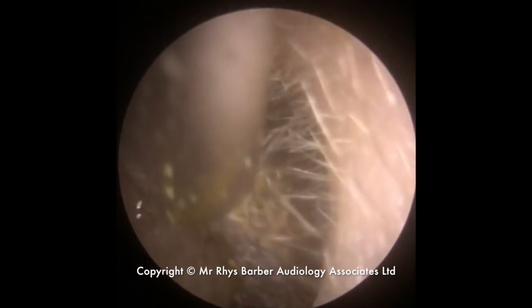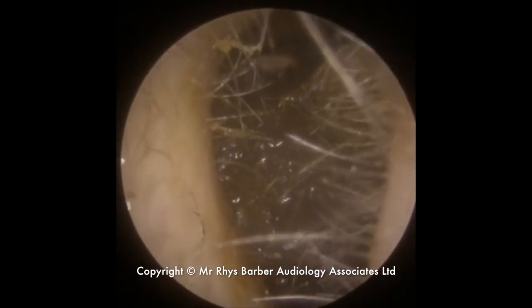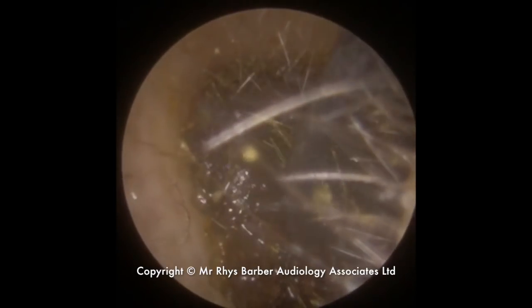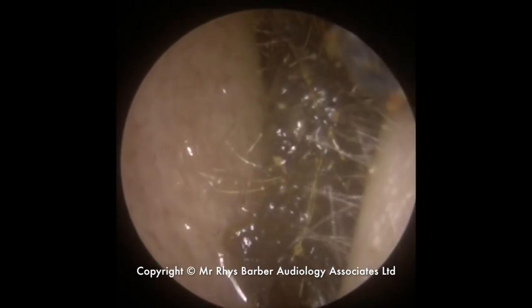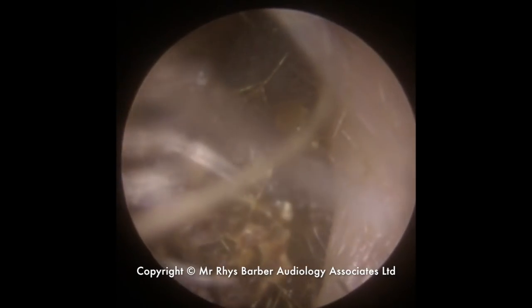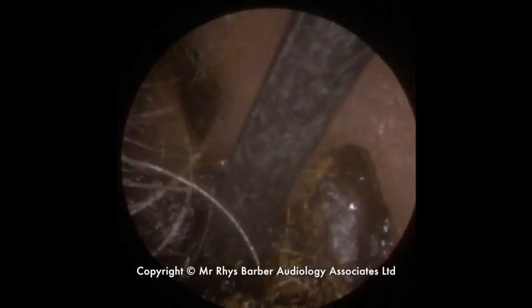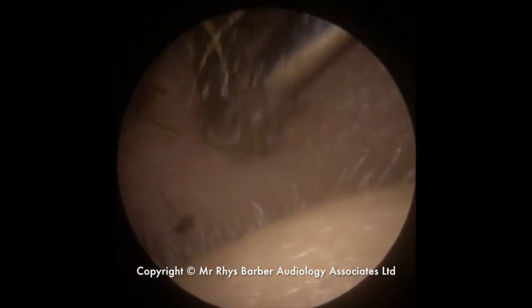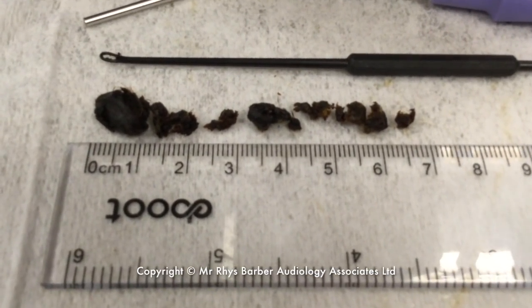Just trying to wrestle this out. Broke a little piece off the end. We'll use the Jobson horn to get behind this block — you can see it's just difficult to get behind it, just pulling it forward slightly. Just starting to roll now. Didn't want to let me pick it up, so we just used the suction to get those pieces away. And there's the eardrum — looking nice and healthy.